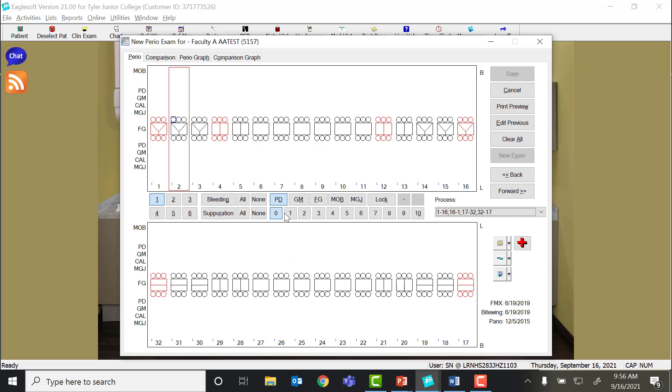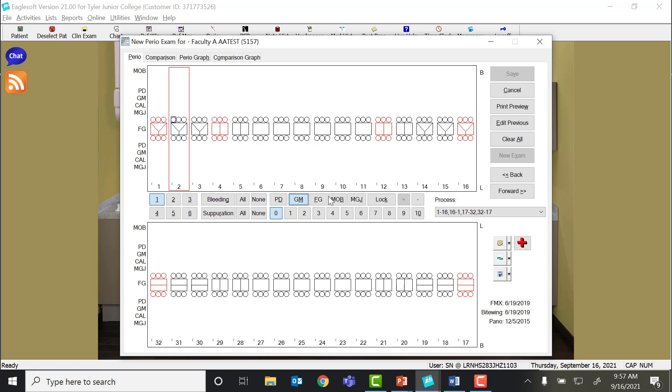You're going to want to make sure that you have the probe depth button selected. If you get off, then you could easily type in all your numbers on the wrong line. The PD is for probe depth. We have GM for gingival margin. When you're documenting recession or enlargement, you'll click the gingival margin button. FG is for furcation grade, mobility, and mucogingival junction.